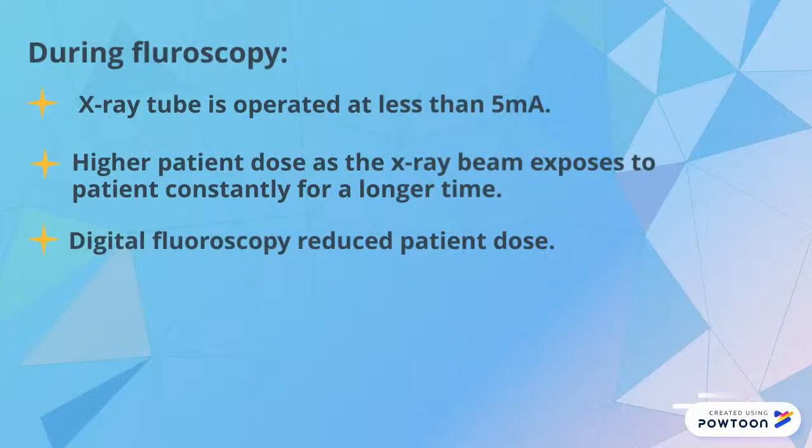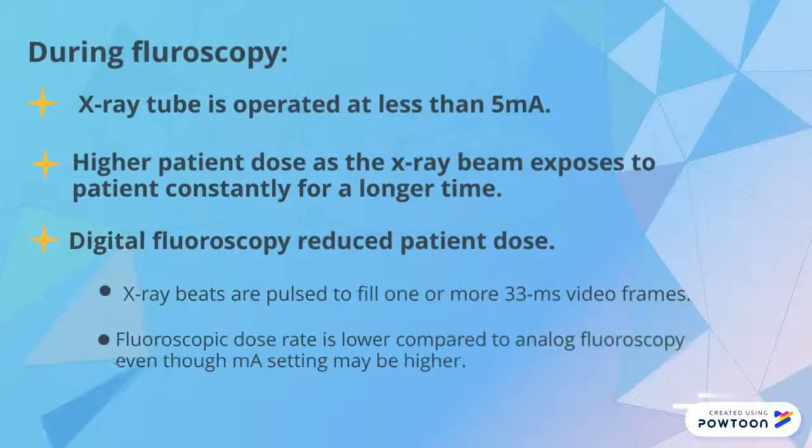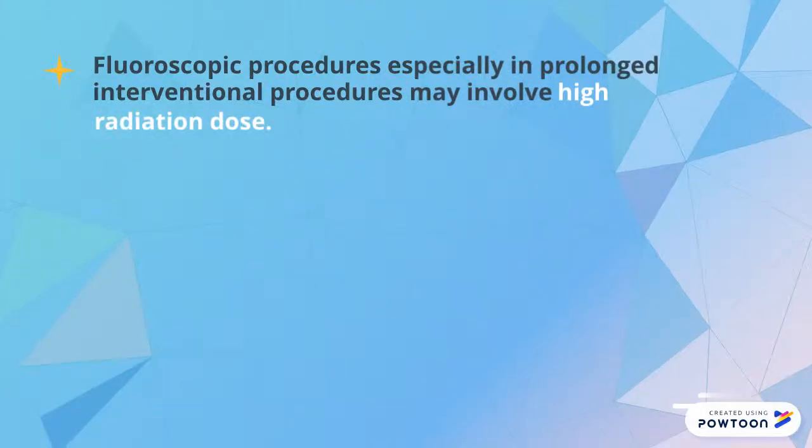Digital fluoroscopy reduces patient dose as X-ray beams are pulsed to fill one or more 33 ms video frames. Therefore, the fluoroscopy dose rate is lower compared to analog fluoroscopy, even though the mA setting may be higher. Fluoroscopic procedures, especially prolonged interventional procedures, may involve high radiation dose.